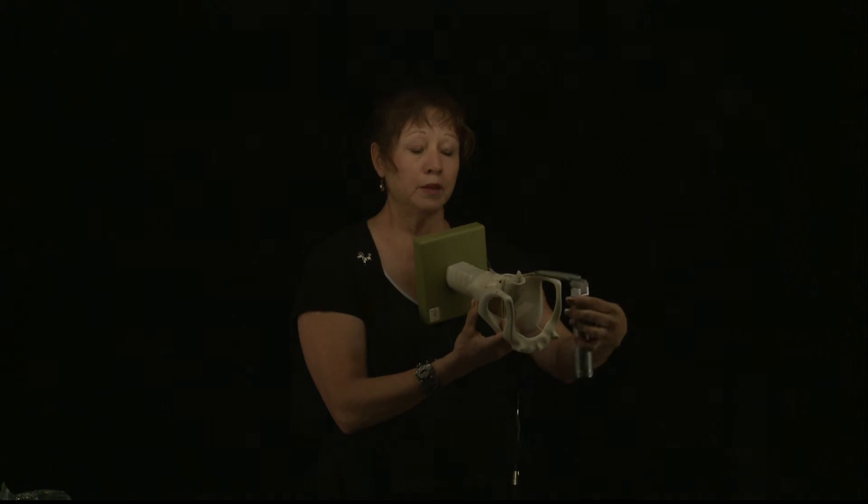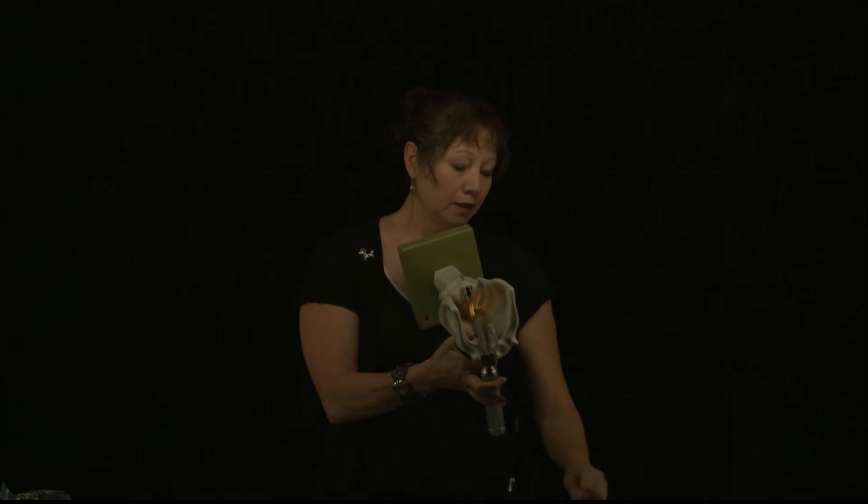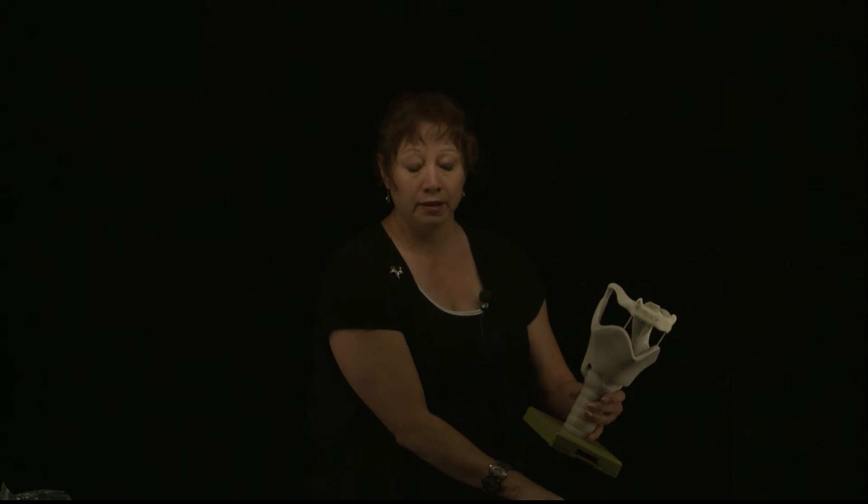This is a standard canine small animal laryngoscope. It does have a light source on the end. You would take the blade of the laryngoscope and gently — knowing that this is a metal object, you want to be gentle — use it to tease the epiglottis away, and at the same time go ahead and pass your endotracheal tube into the trachea. It's very important to be gentle on your animal. We don't want to cause any kind of unnecessary swelling, edema, or trauma in that area.